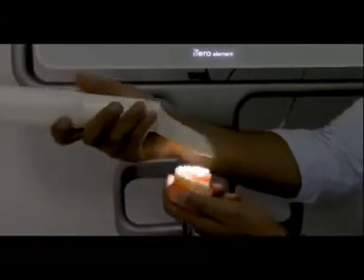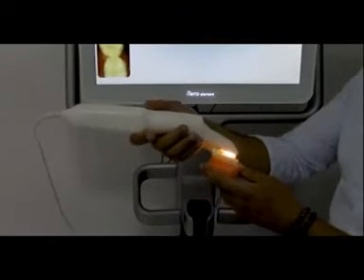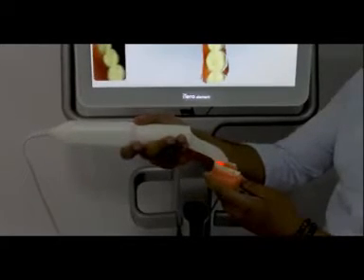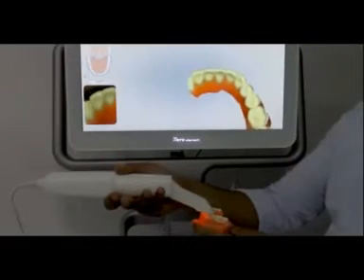We always suggest that you sit behind the patient, at 12 o'clock, and hold the scanner like this, because there are fans on here, and if you block them it overheats the wand and it will start shutting off. You then press this button once, and keep in contact.